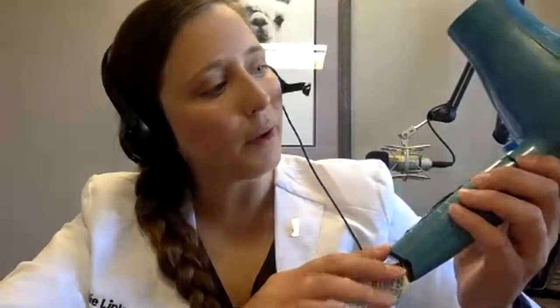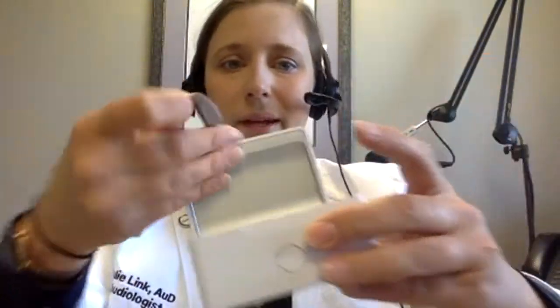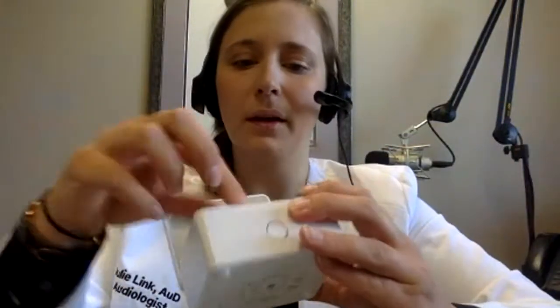Mine usually has a little button on top. Use that to blow dry your hearing device off, just like this. Then lay it out to dry. Don't put it in the sun. And I'll be sending this to my dad later, I don't think he has one. If you have a dryer, put it in there, and that'll help pull out that moisture.